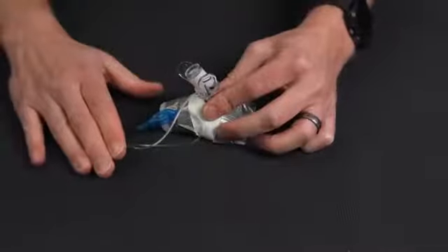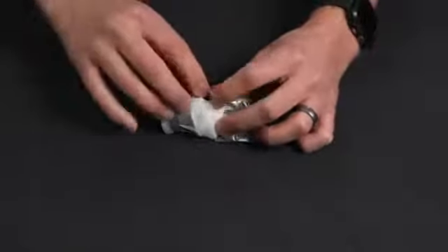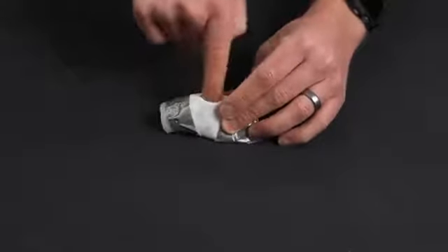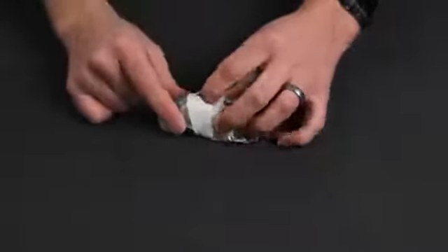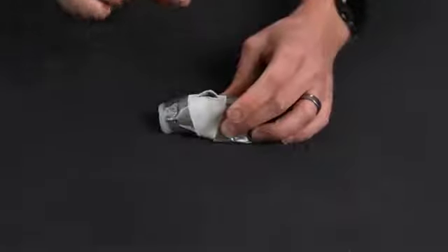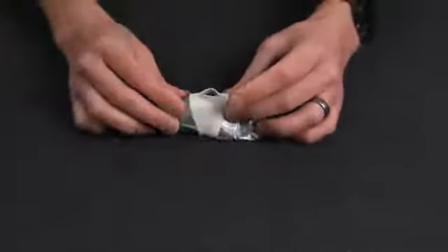A couple important points with this procedure. It is really important that when we make that first incision and then we make the second one, that we are limiting the time that there is nothing in this orifice we have created. Because if we release that, if we don't have a finger in there, we could actually lose the through and through hole we have. The skin could move and the trachea could move in an opposite direction.